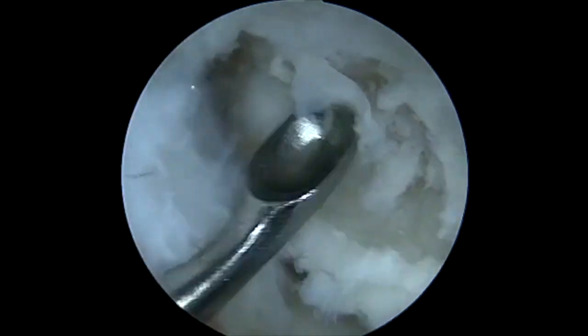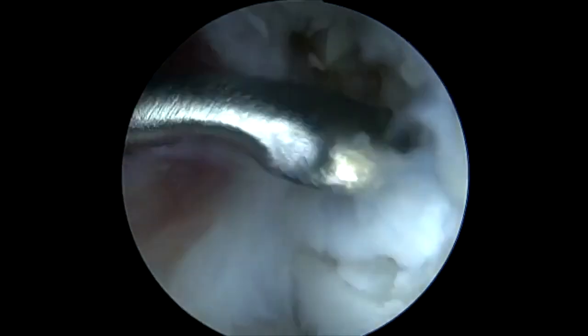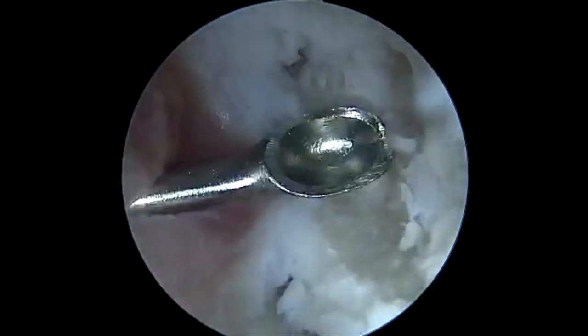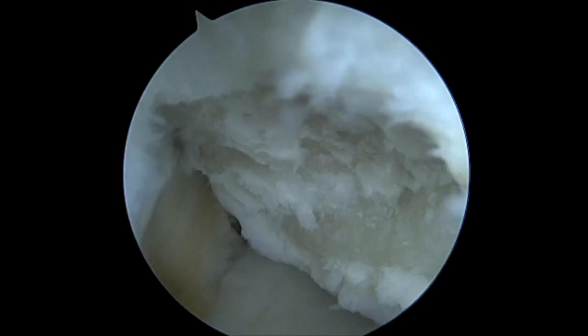Once this is fully debrided you can see here we've made a nice base. We're just finishing off the peripheral edges with the curette and following we'll do a shaver one more time. We now have a good subchondral bone identified.